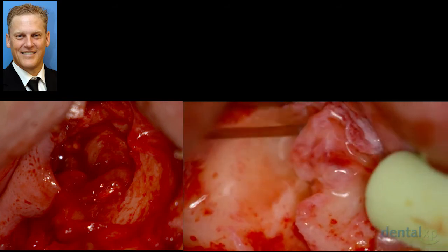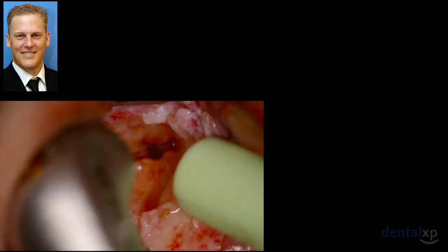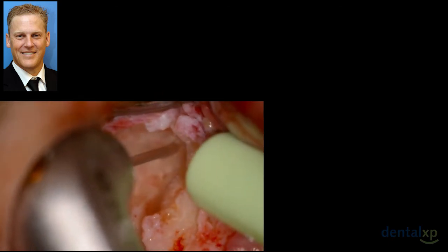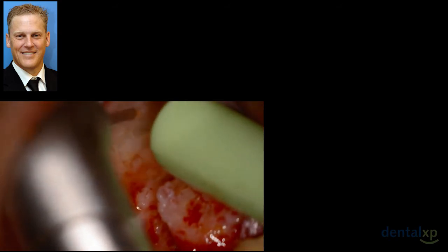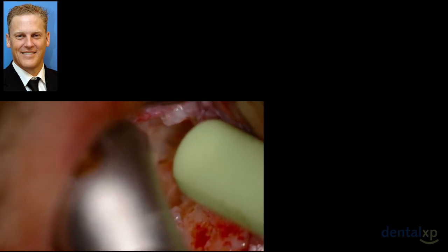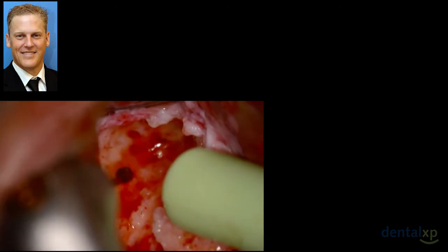After the soft tissue has been removed, we have to turn our attention to decortication of the site. We use the same tip, and unlike with a burr, we just use a lot of water here. We'll actually make little indentations and puncture marks through the lamellar bone into the marrow spaces. This releases osteogenic potentials of the cells within the marrow spaces, and they can be released to help you with your grafting procedure. And you can see the release of the cells right here.